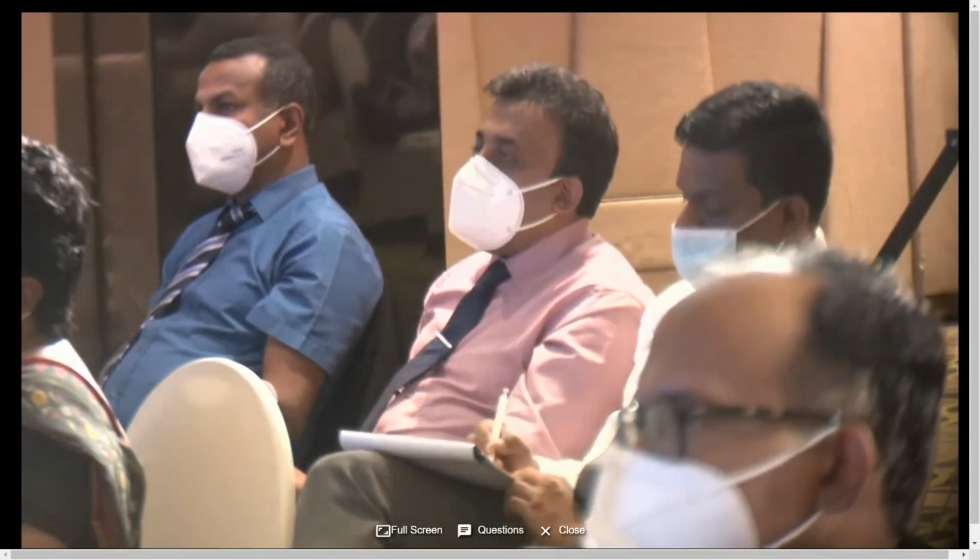Having this, I would like to ask you, sir, what is your preferred choice of intervention for this kind of lesion? Now the question is, is this a significant diagonal? Looking at the guiding catheter, which is 6 French, or 7 French, I think. If it is 7 French, it's 2.5, and the diagonal looks at least 2.25, and it's more than 6 centimeters long, and the lesion in the diagonal is more than 10 millimeters.